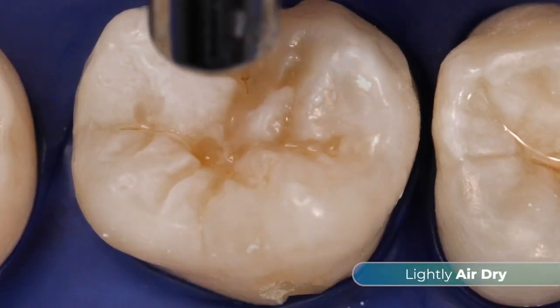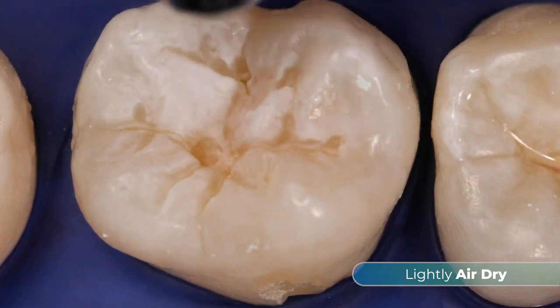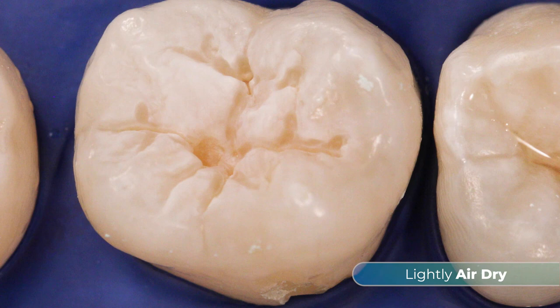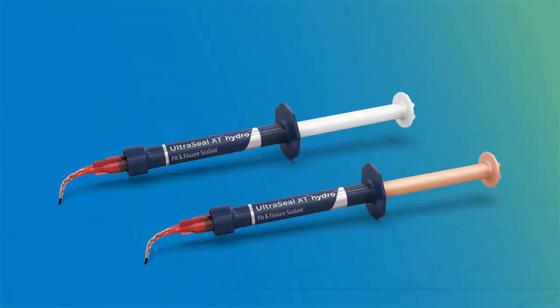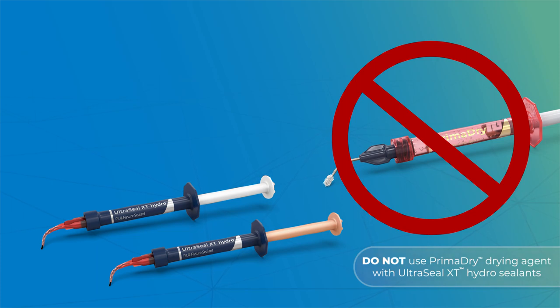Lightly air dry the tooth to remove visible moisture. This allows the hydrophilic chemistry to flow deep into the pits and fissures. Do not over dry or desiccate the tooth. It's important to note that PrimaDry drying agent should not be used with UltraSeal XT Hydro Sealant.